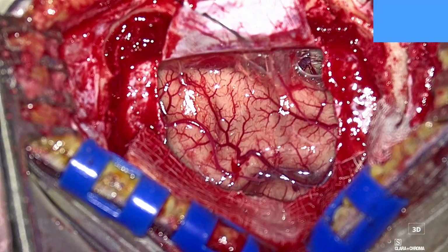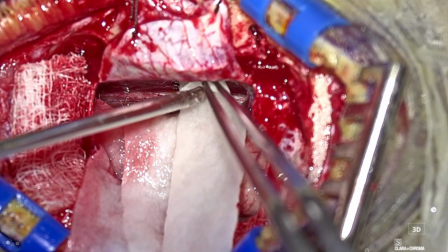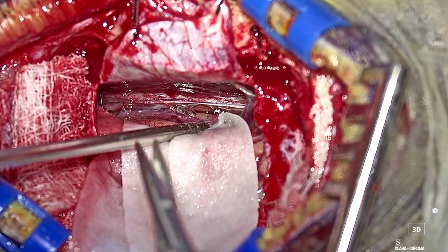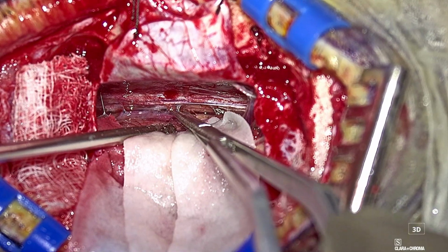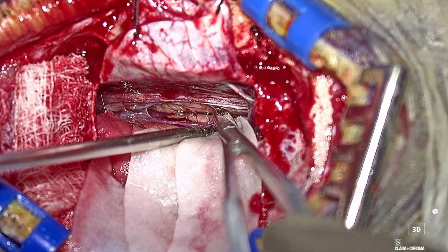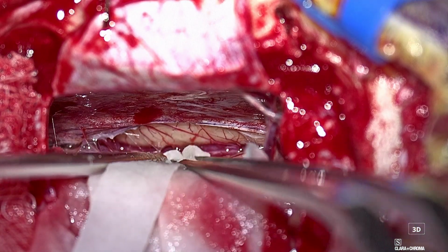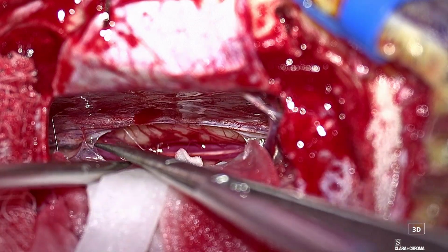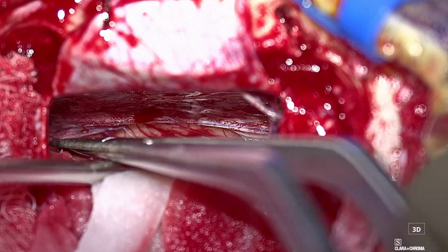This dura was secured in situ. The arachnoid adhesions in the midline were separated and an interhemispheric approach was resorted to. Dissection was further deepened. The ipsilateral and contralateral cingulate gyri with the pericallosal arteries running over the corpus callosum were identified.